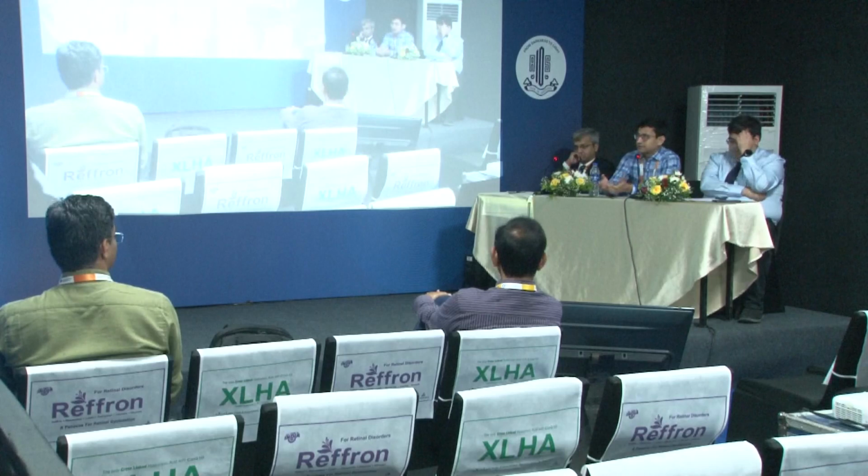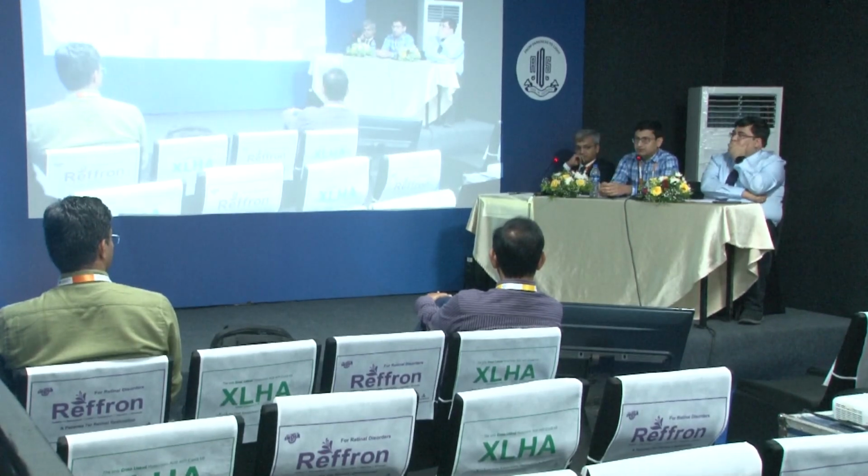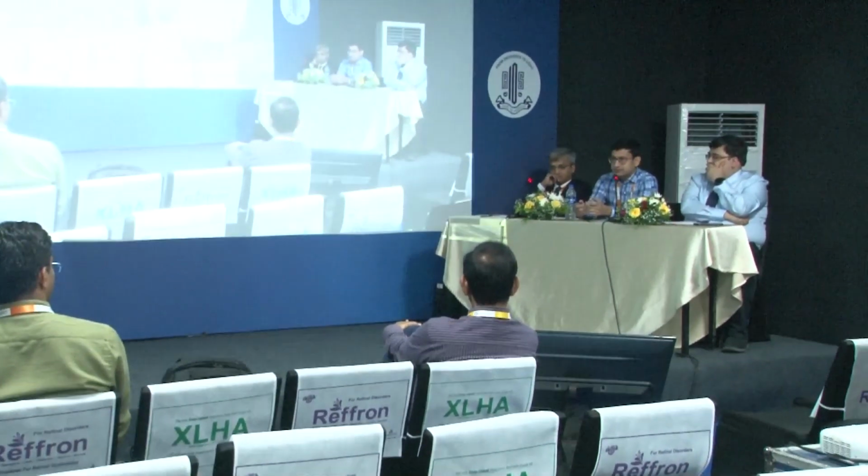So when you do that, when it retracts, when you cauterize, or when you do these maneuvers, does it affect the tilt? Does it cause any astigmatism, or does it move inside? No, not really, sir. There's no tilt. It stays stable throughout.